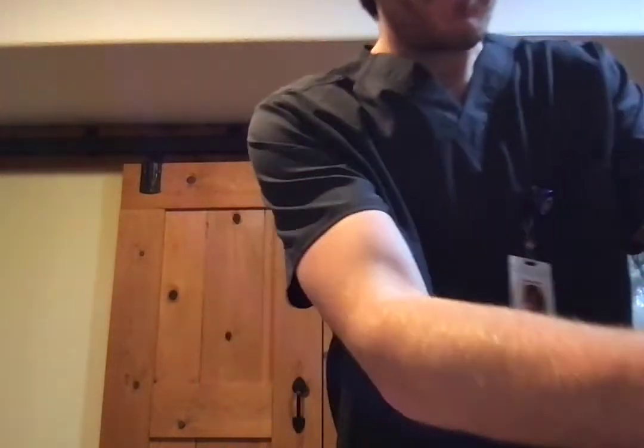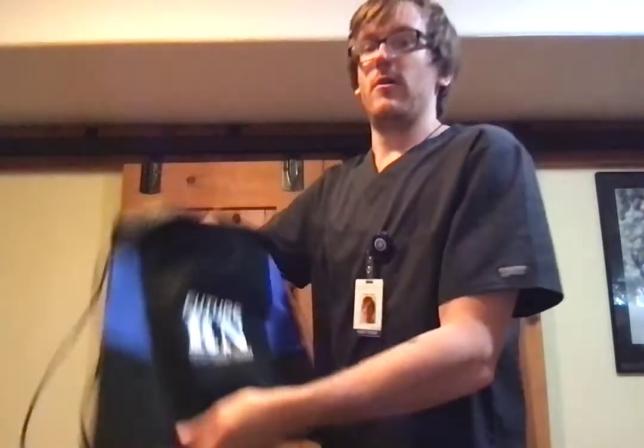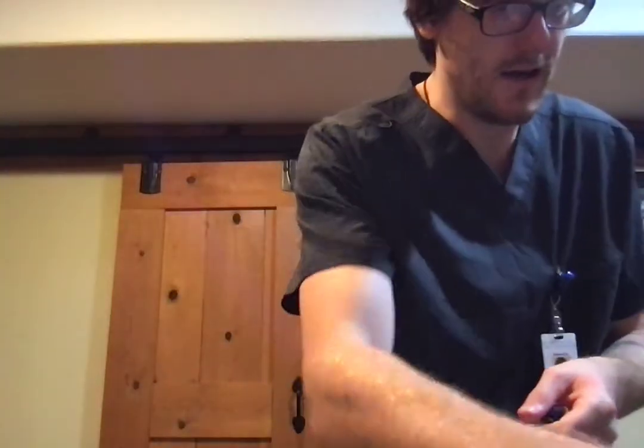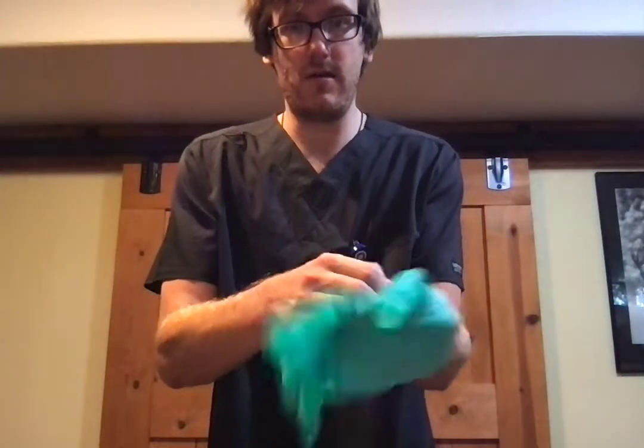So, introduce myself, and I already verified with this patient, so I'm going to wash my hands, but remember, we're just pretending. And then also for this, I need a biohazard bag. In my kit, I was not provided with one, so I'm just going to pretend and use my future of nursing bag as my biohazard bag for this simulation. So I washed my hands. I'm going to put my clean gloves on.